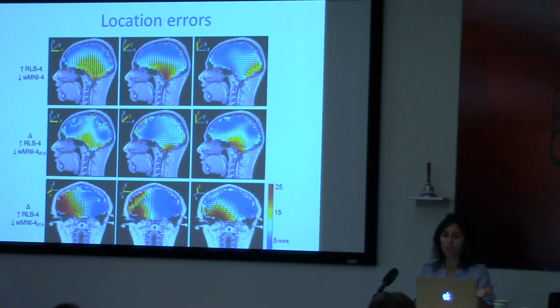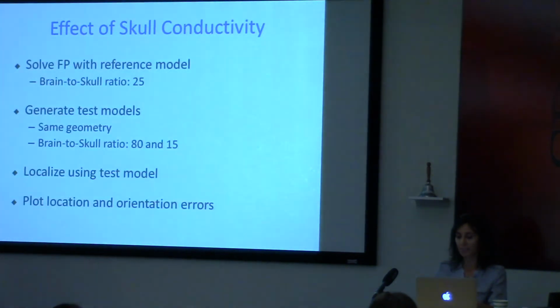So it doesn't make any sense to have only 16 electrodes. So as a result, in summary, the optimum would be to have more than 64 electrodes evenly distributed on the head surface.